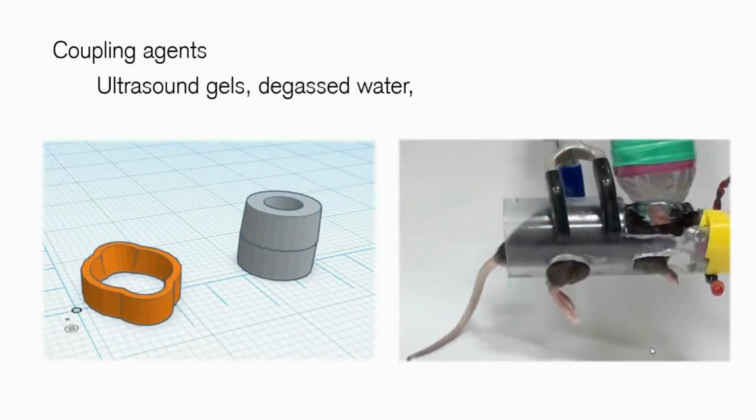And then for coupling to the animal's brain, if you're new to the field, this is a little bit daunting, and I would advise you to not be scared about it. There are a ton of ways to couple to the skull. The way that I do it is I 3D print these little brackets and fill them with gel or Vaseline or whatever. You can't use water in most cases because it'll bleed out, but you can just throw gel in there and then stick your transducer in.